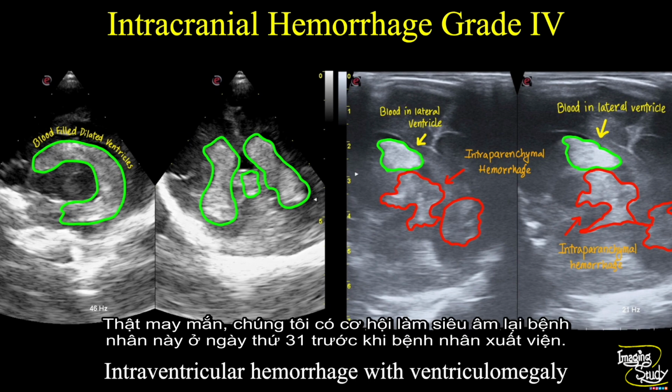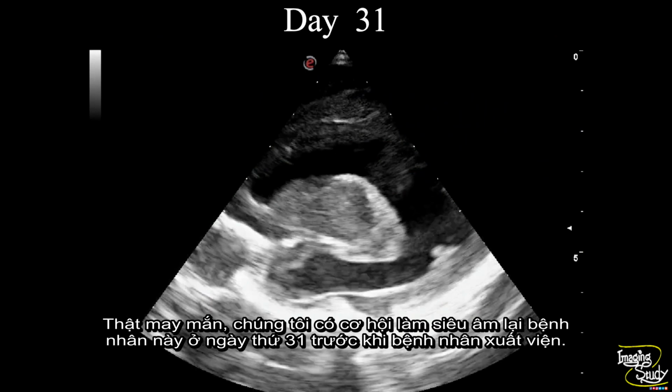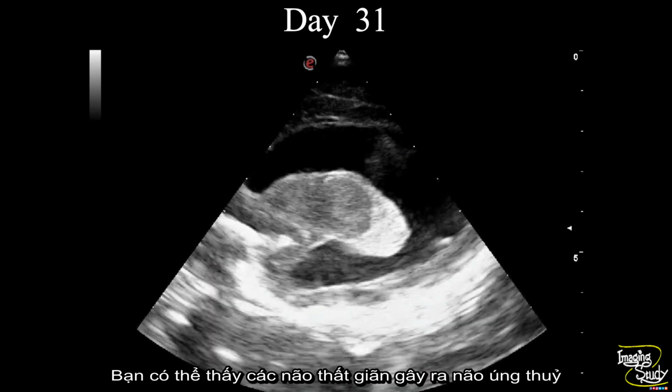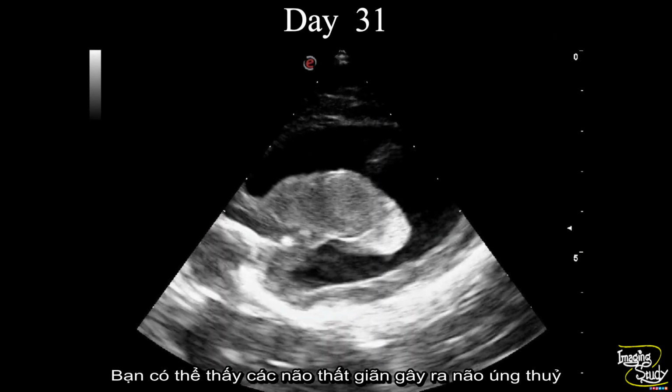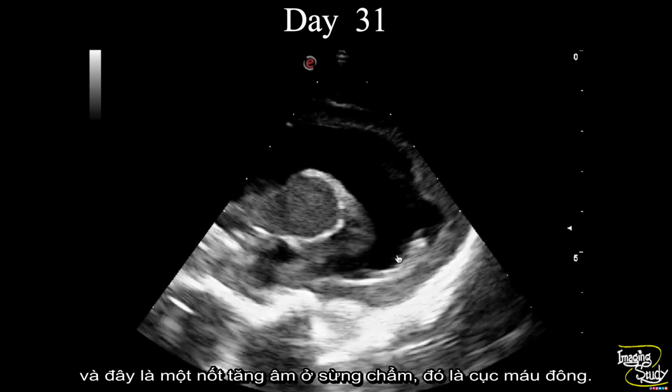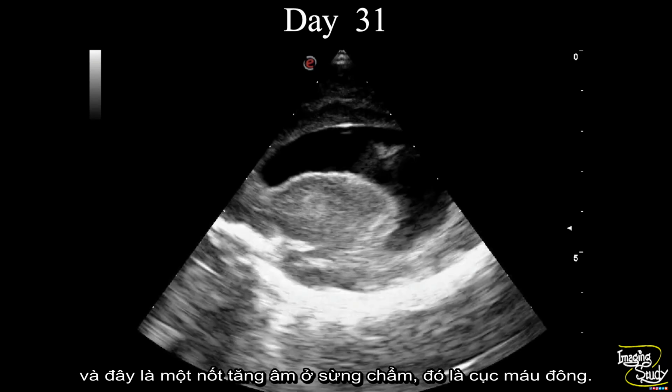Now fortunately, we have the opportunity to repeat the scan in this patient, and on the 31st day before releasing the patient, we scanned again, and you see the ventricles are dilated here, forming hydrocephalus, and there is an echogenic focus at the occipital horn region which is nothing but the retracted clot.